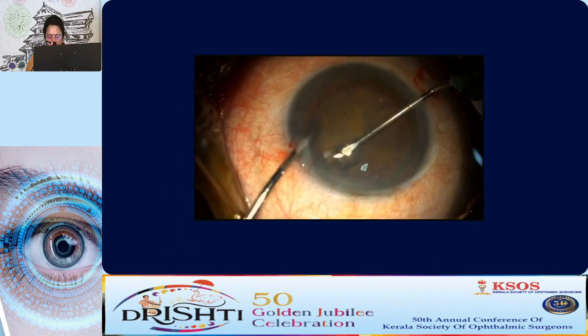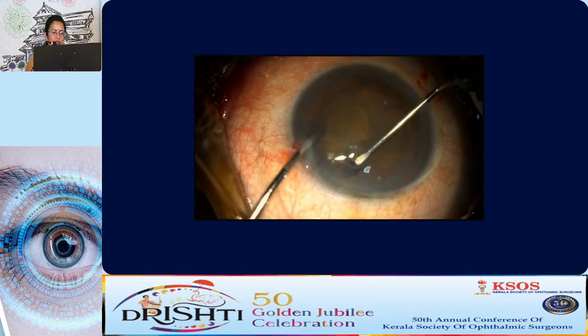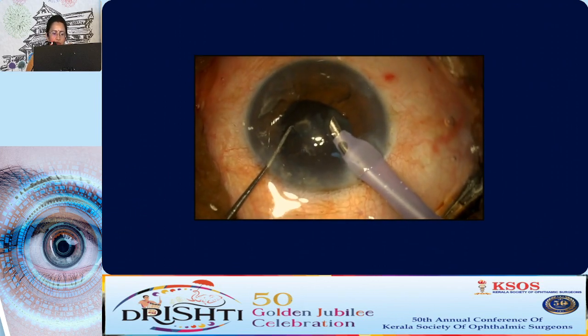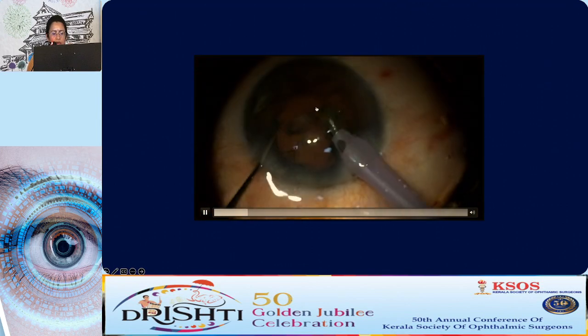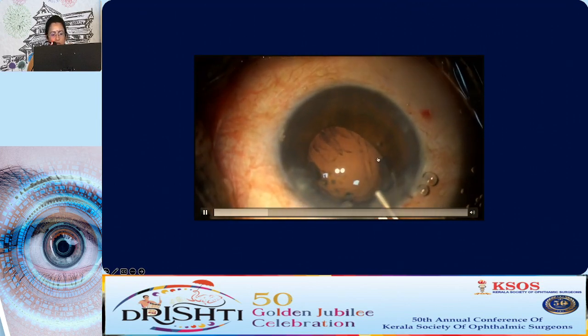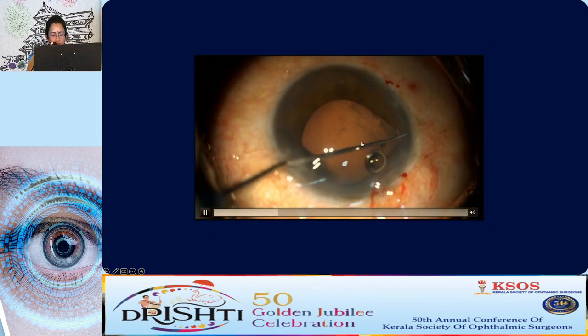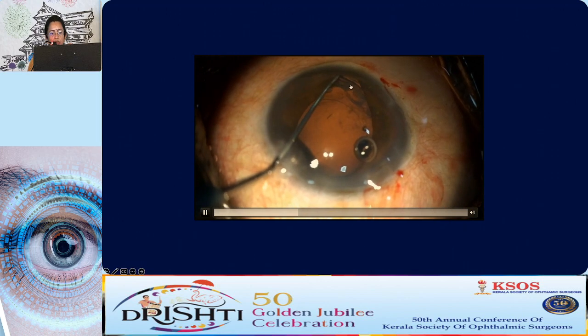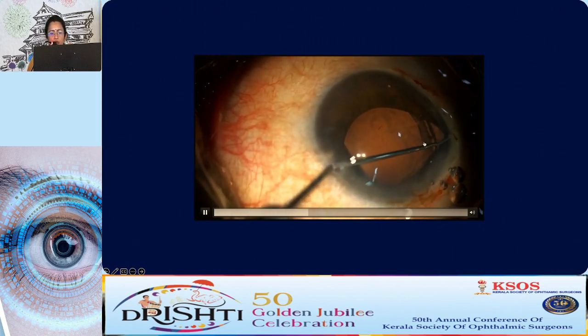In this patient, everything was going fine till the completion of emulsification, almost up to the completion of emulsification. Then I could see the rhexis margin coming forward here. So this was an ominous sign. So I put OVD. Then when I retracted the iris with Kuglen hooks, I could see the large area of zonular dialysis here, about 4 to 6 clock hours.